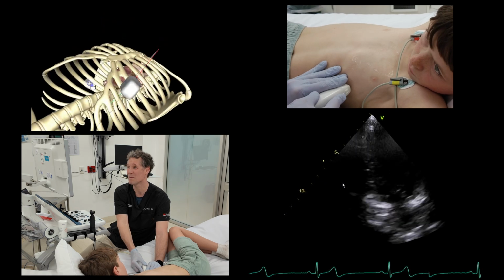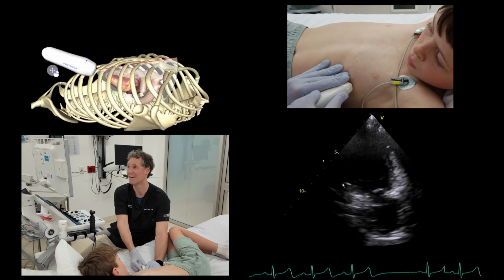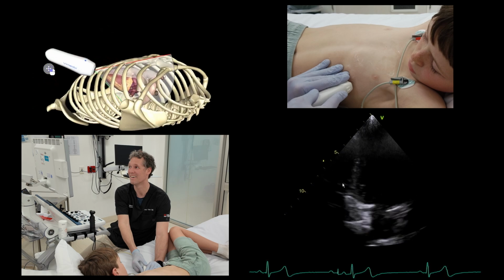Take a big deep breath in for me, buddy. And breathe out all the way. And hold it there. Yeah.